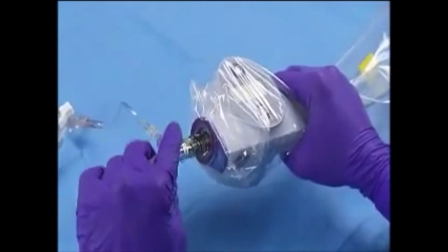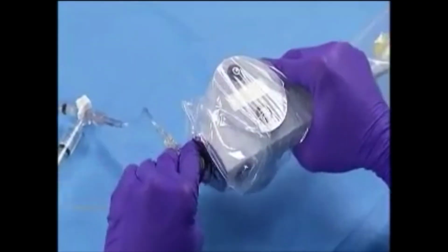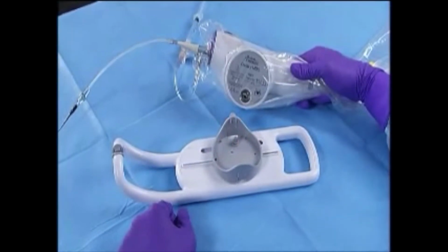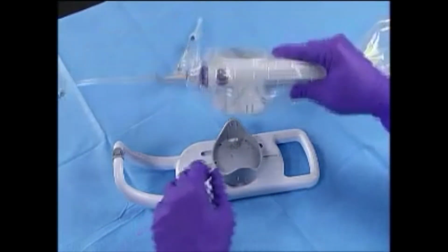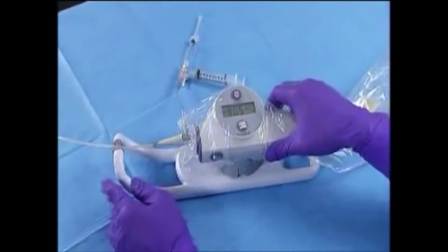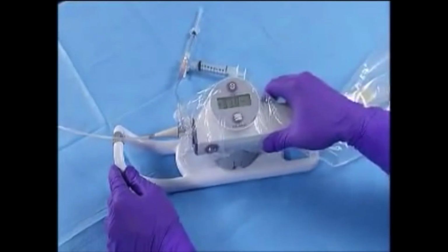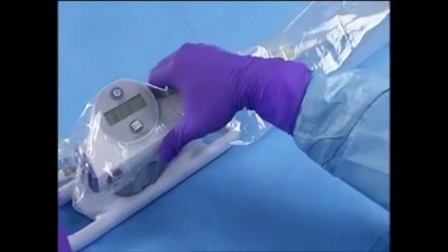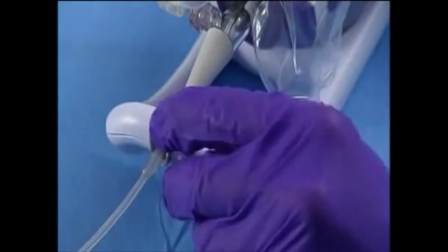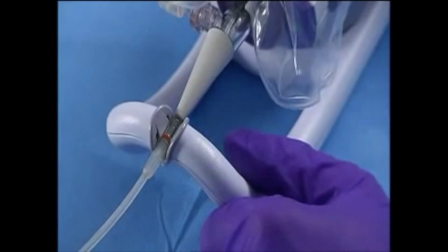And listen for a click, indicating the catheter is fully engaged. Then, when a disposable pullback sled is being used, connect the motor drive to the sled cup, ensuring that the motor drive engages firmly into the sled cup and pierces the sterile bag. Slide the motor drive to the distal-most position so that the catheter's imaging core is as close as possible to the sled nose, and press the catheter's anchor housing into the anchor post located on the sled nose.